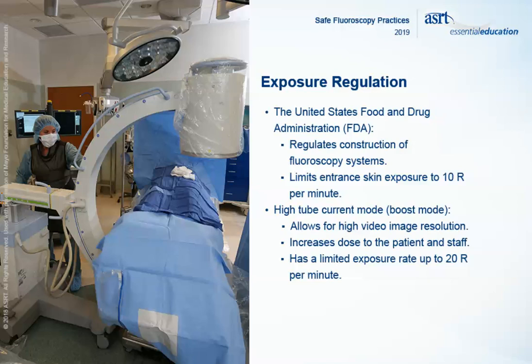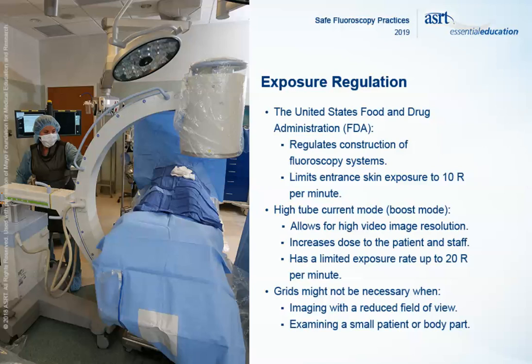The use of grids in fluoroscopy studies might not be necessary, especially when imaging with a reduced field of view or when examining a small patient or body part. If the fluoroscopy unit has a removable grid, operators should consider removing it during pediatric exams in particular.